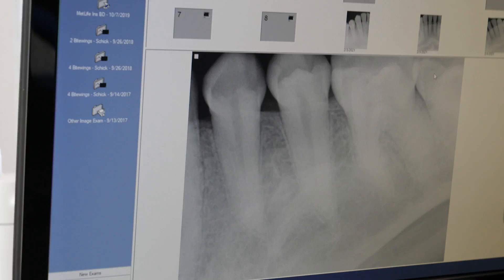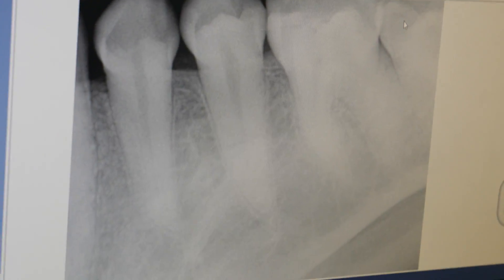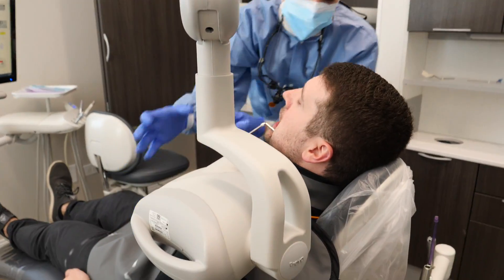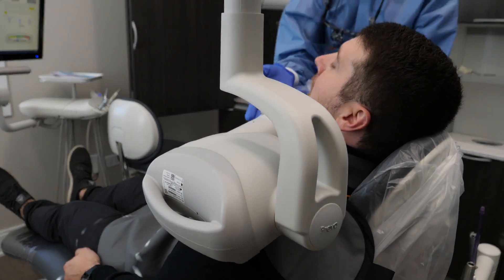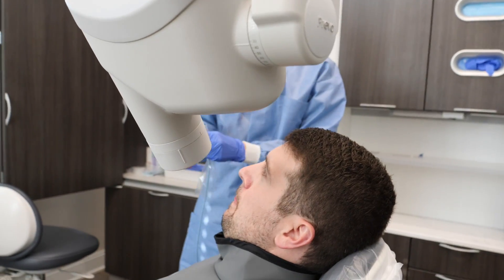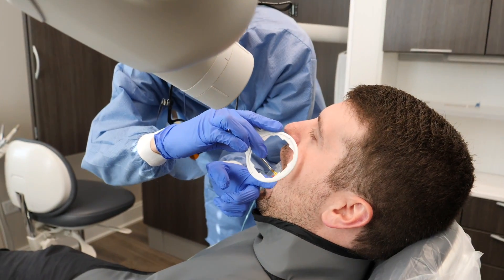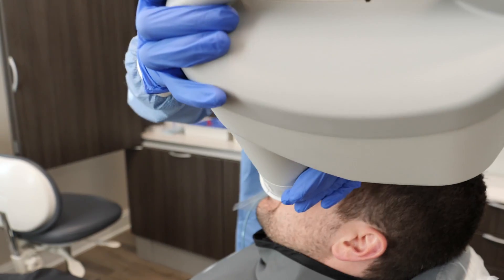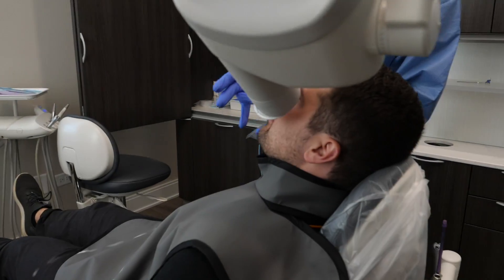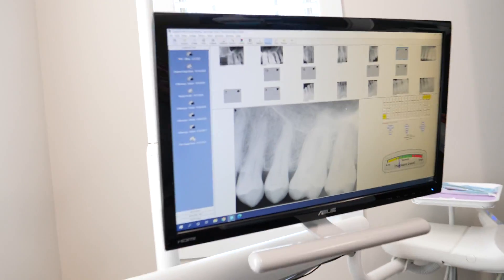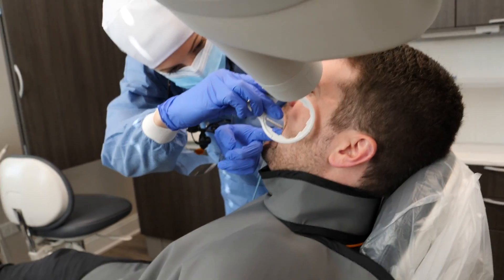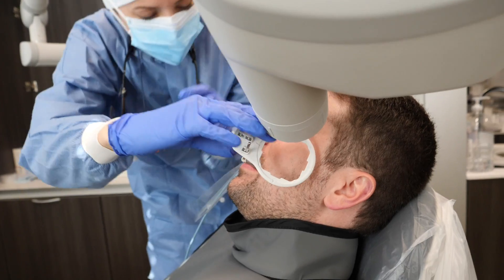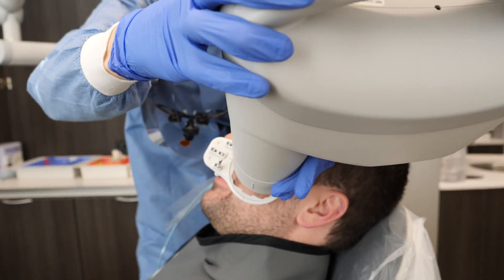Right now we're doing the posterior PAs and as you can see it's pretty repetitive. We take the image, leave the room, press the button, wait for it to load on the screen, reposition it for the next section, and repeat. If you're someone who has trouble with x-rays — if they are very uncomfortable or you have a severe gag reflex — I do have a video with tips and tricks to help make your x-ray experience more pleasant, which I'll link in the bottom bar below.